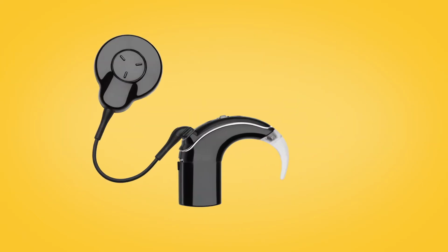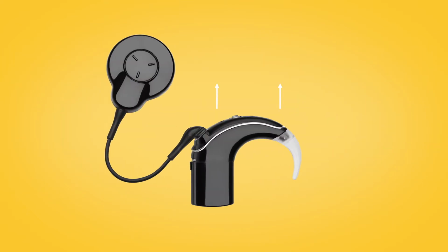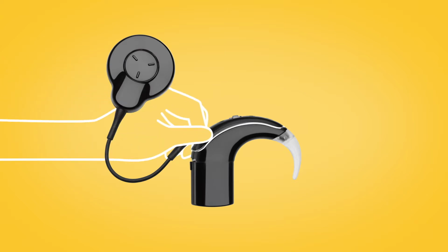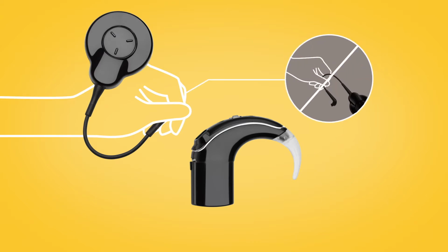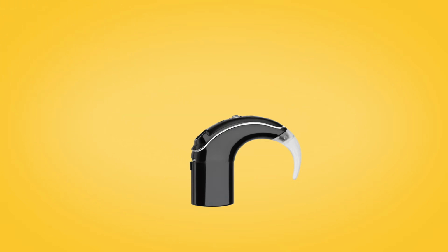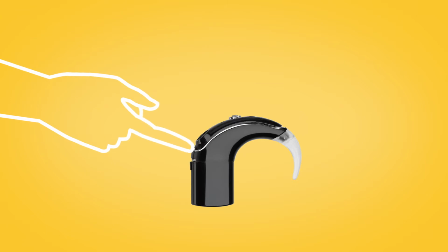First, you need to remove the old microphone cover. Hold the coil cable grip and firmly pull it straight out of the sound processor. Do not tug on the flexible part of the coil cable, and be careful not to twist the coil cable when you pull it out. To remove the microphone cover, use your fingernail to lift it from the bottom edge.